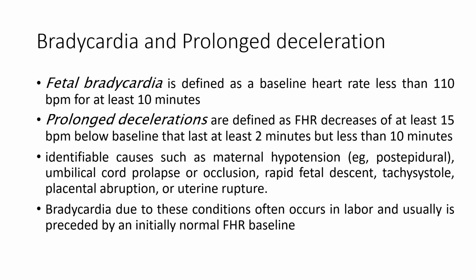Bradycardia and prolonged deceleration. Fetal bradycardia is defined as a baseline heart rate less than 110 for at least 10 minutes. Prolonged deceleration is more than 2 minutes and less than 10 minutes. This can be seen in maternal hypotension after a patient takes an epidural, if there's sudden umbilical cord prolapse or complete occlusion, or if there's rapid fetal descent, or a placental abruption or uterine rupture.